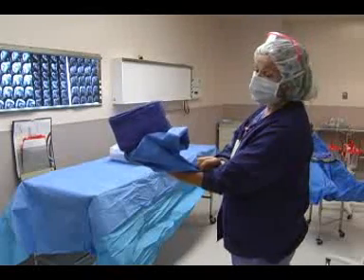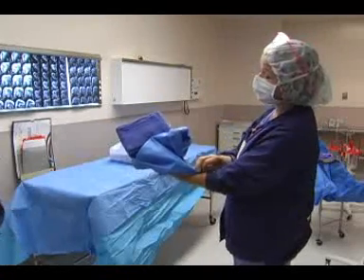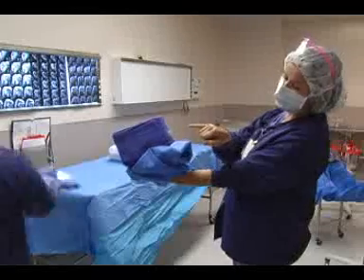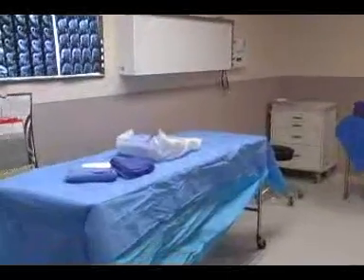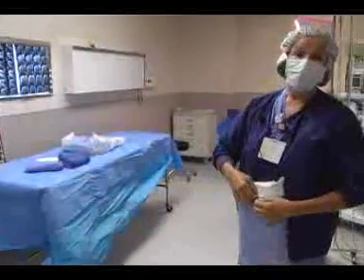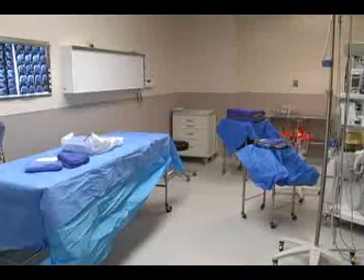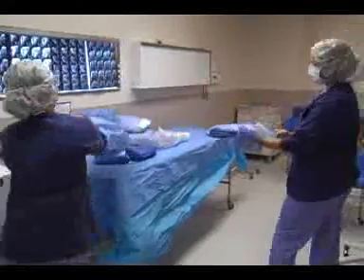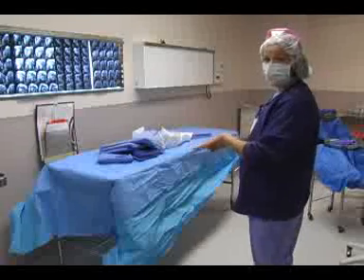There's an indicator inside each pack that we sterilize here within the hospital. The colors of the indicator will tell you whether sterilization has been achieved — our color is black for this particular indicator, so I can see that this has changed to black, meaning we can place it on the field. Anything that comes from a manufacturer, we are assured of sterility, and there will not be an indicator, but it's wrapped the same way: outer dust cover, inner package — end up with a sterile mitt and place it on the field. Anytime you're placing items on the field, you don't want to pass your hands or arms over the table.